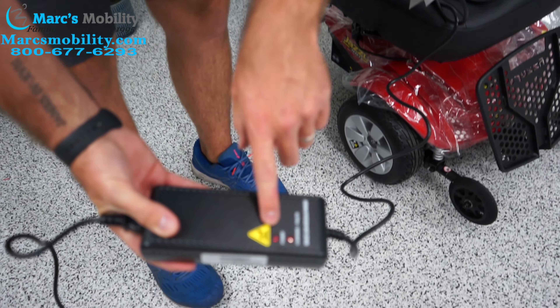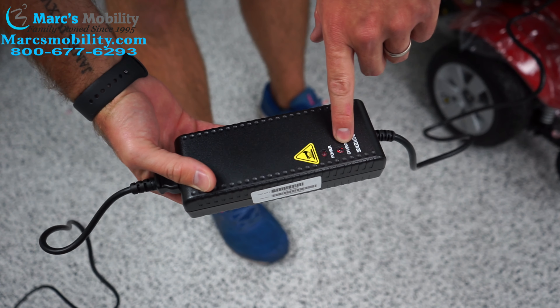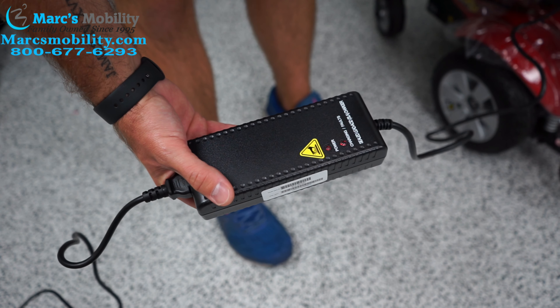This is what your charger is going to look like. On most all power chairs you're going to have a circle with three female end plugs in the bottom of your joystick. You're going to have your charger with three male plugs.